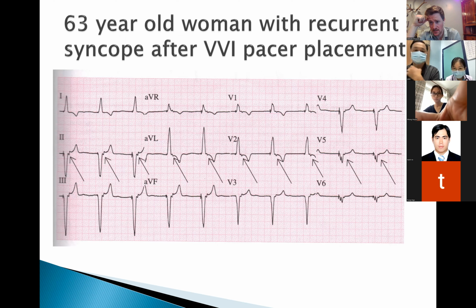Well, we see these P waves, right, in the QRS complex. And so if you were to see this in a patient that's complaining of recurrent syncope, then really consider this diagnosis of pacemaker syndrome, right? Because we see the atria depolarizing in the QRS complex. So they're possibly contracting against a closed valve, which will cause a significant increase in pressures in your atria.